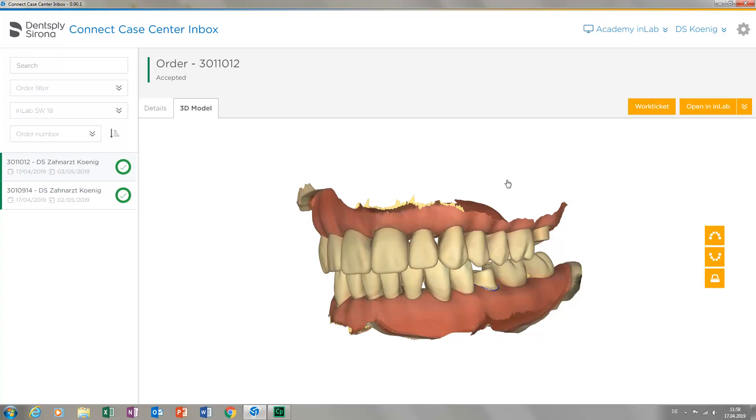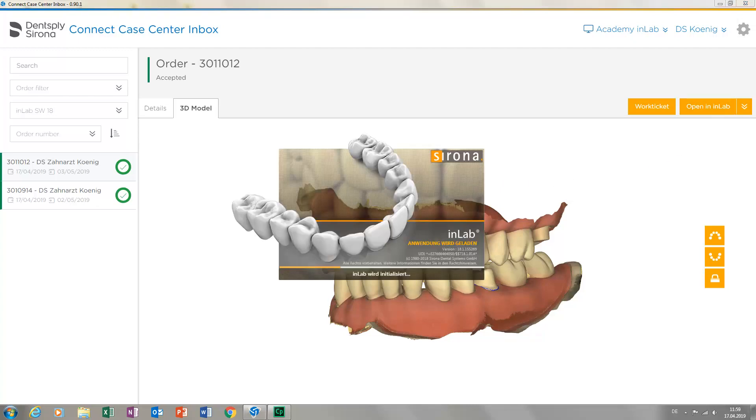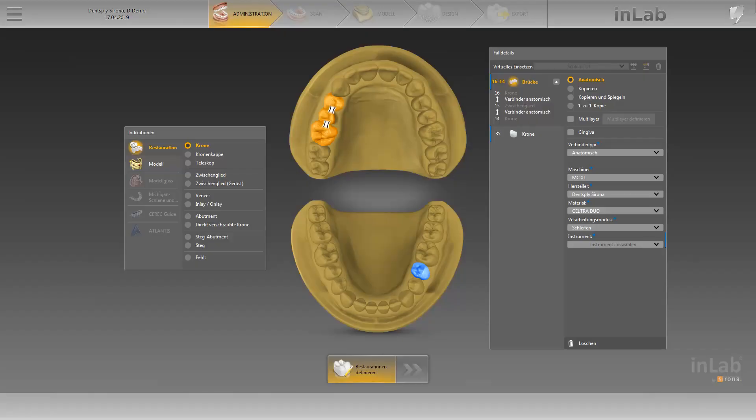To access the scripts, click the icon at the top right of the screen. The InLab software opens automatically and now we can perform final processing of the case with the InLab software.